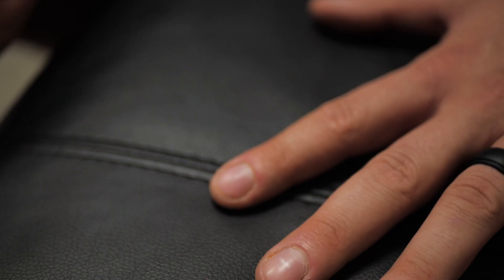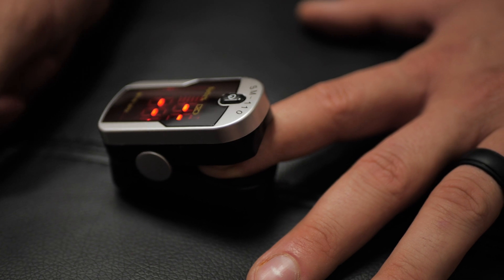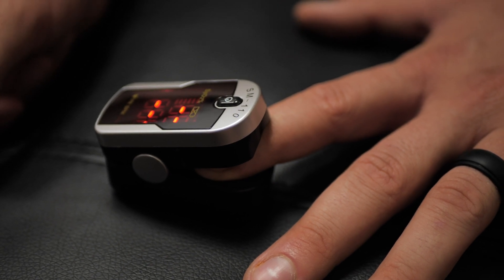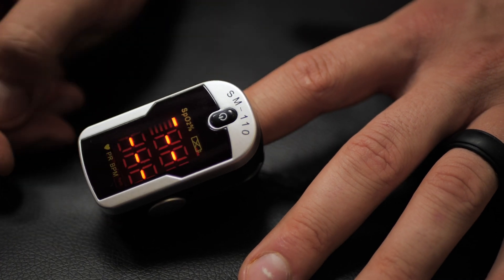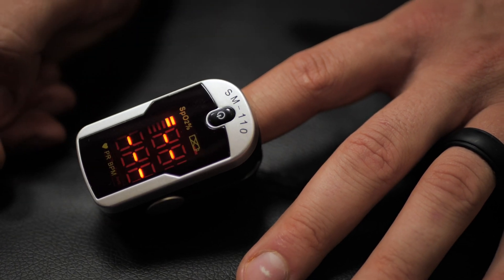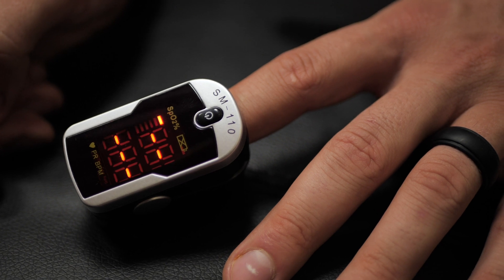One that should be fairly obvious: if your pulse ox is not placed well, you need a good reading of the red and infrared light through the finger or nail bed to get an accurate result. If the pulse ox is not completely on the finger or not on there properly, it's going to have a hard time getting an accurate reading. Make sure it is seated well and firmly on the finger.